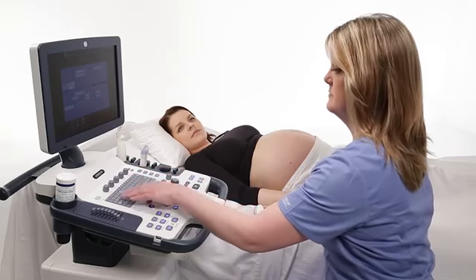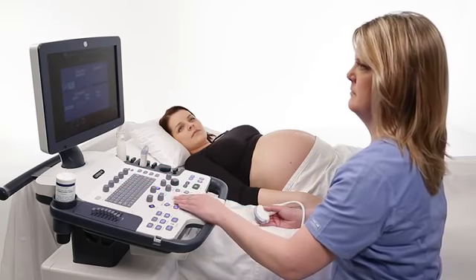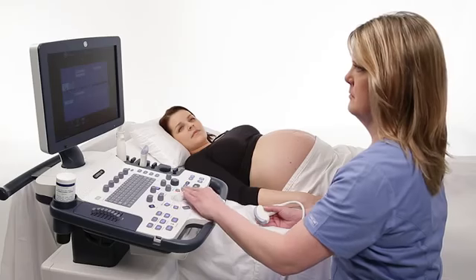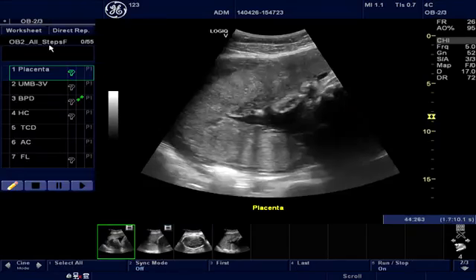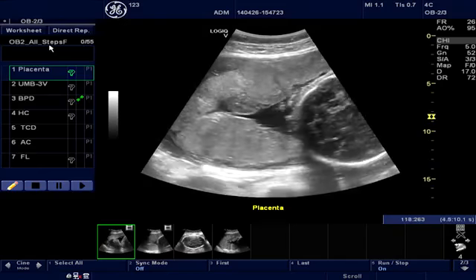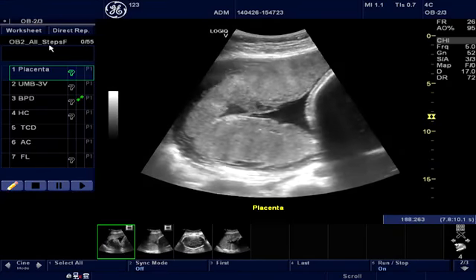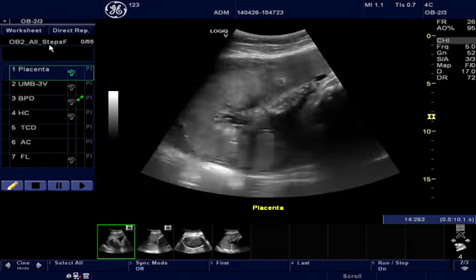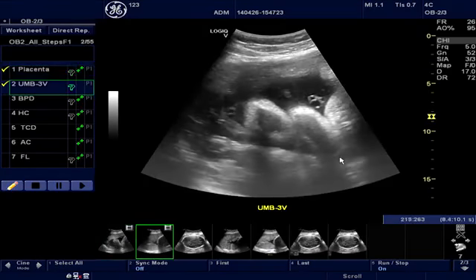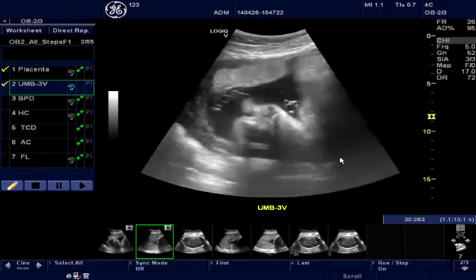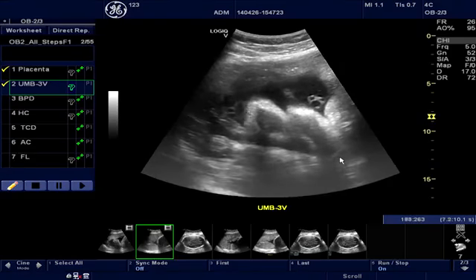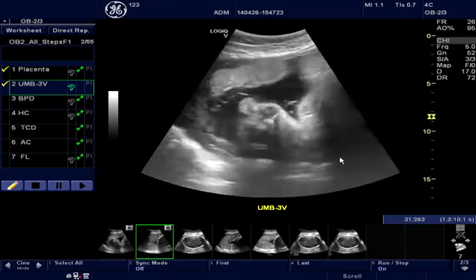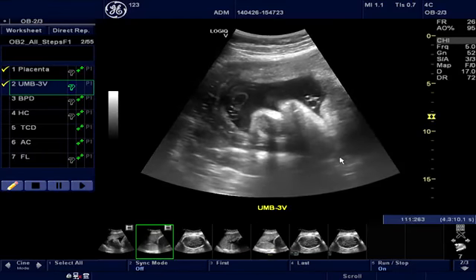Let's walk through a few steps of an active Scan Assistant protocol. The patient's information has already been entered into the system. Once the probe and preset have been selected, the user selects the relevant protocol from the Scan Assistant drop-down menu on the Patient Information screen. You will see the Scan Assistant display description on the left side of the monitor. Verify the program name, the program's step status, and what is required within the various steps. For the OB2 protocol, you will see the suggested views and the suggested P1 or store action. Once that view is stored, a check mark will appear and the Assistant will move to the next view, highlighted as the active step with the green box.